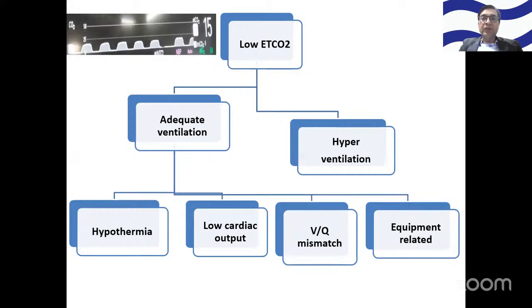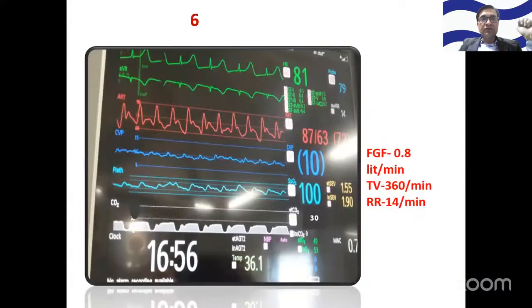Or it could be equipment related. There will be some leak somewhere, or zero is not done properly. So these could be the possibilities with low EtCO2 with adequate ventilation, right? Next scenario.